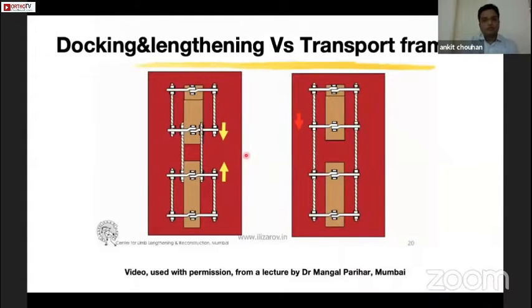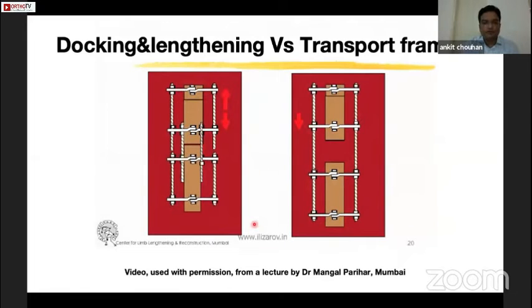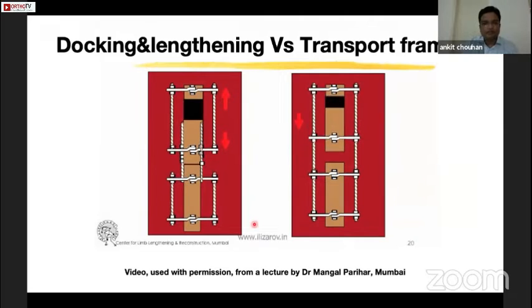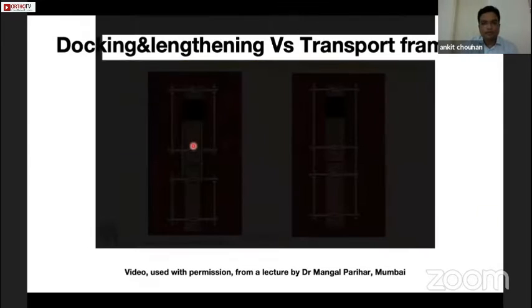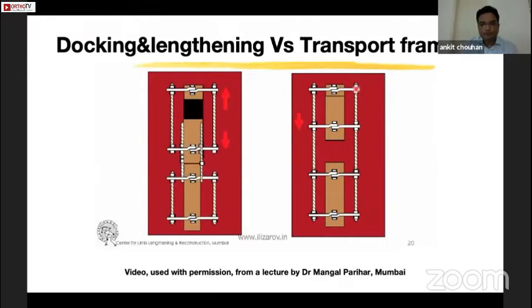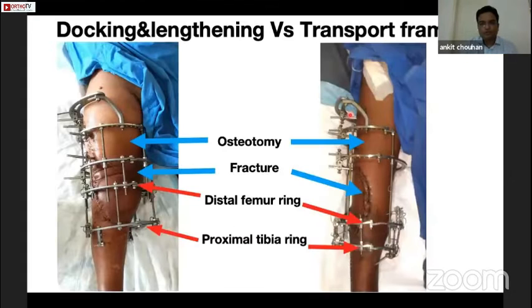To highlight these two techniques, a video shows them separately. The first video is of a bone docking and lengthening frame, where different sets of rods connect the rings and lengthening and docking proceed separately. On the right side, the bone transport frame uses a single set of rods bridging across the gap, and the rate of distraction at the osteotomy equals the rate of compression at the non-union site.